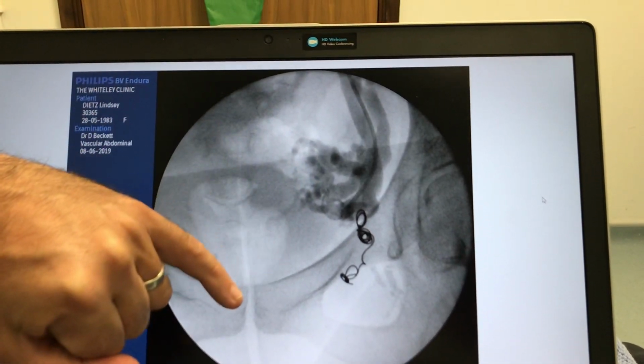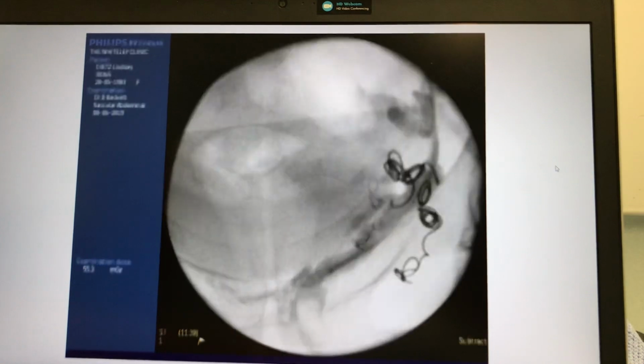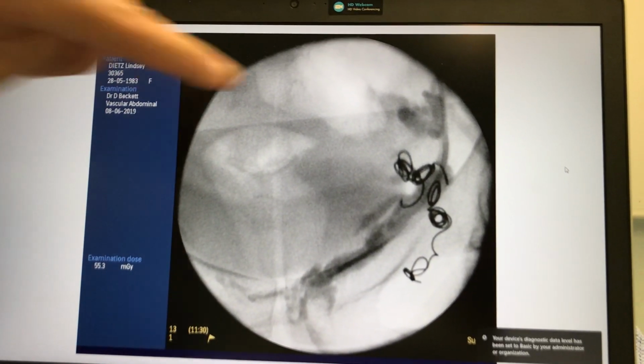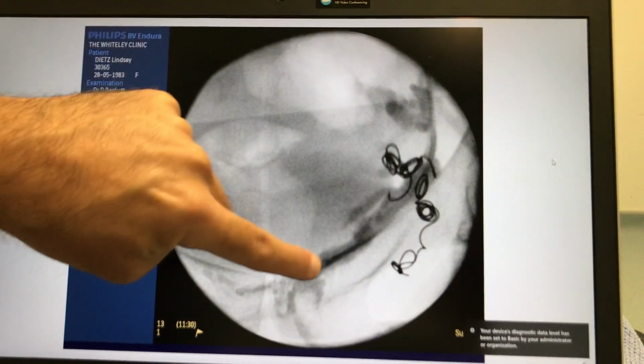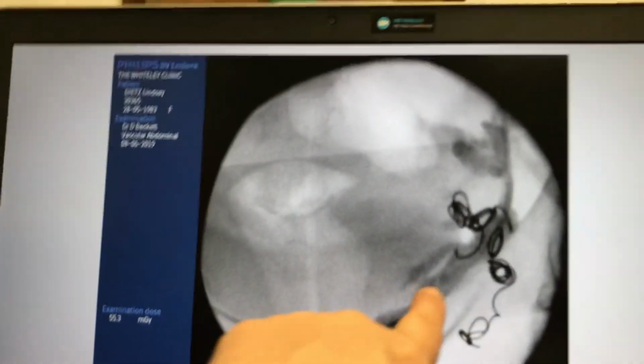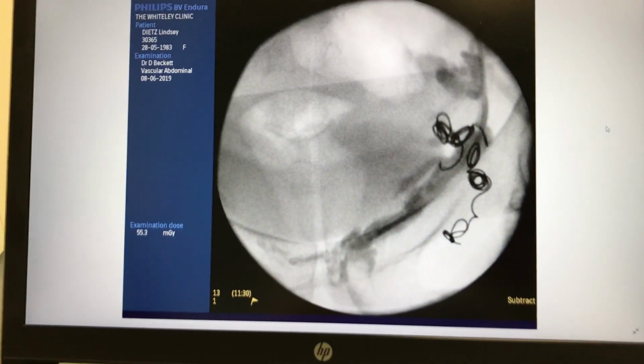And next you can see the catheter coming down here into this vein, and what I'm trying to do is I'm trying to get into a vein that comes down this area, and that's going to be called your pudendal vein, okay? So then that image now shows the catheter. It's magnified up now, but the catheter is coming all the way down into this pudendal vein. The dark area, like what looks like a shadow. Yeah, that's the vein. That's the contrast sitting within the vein.